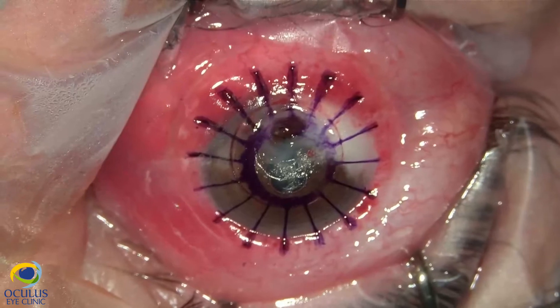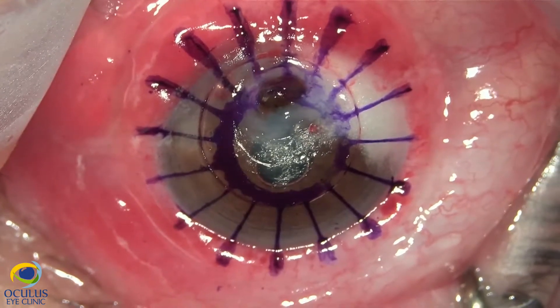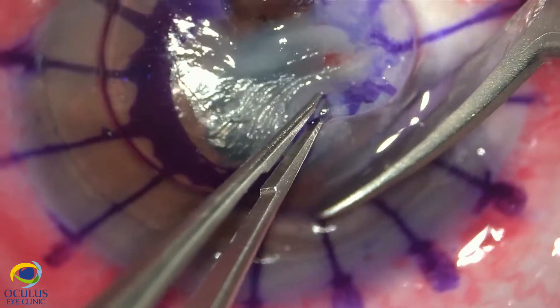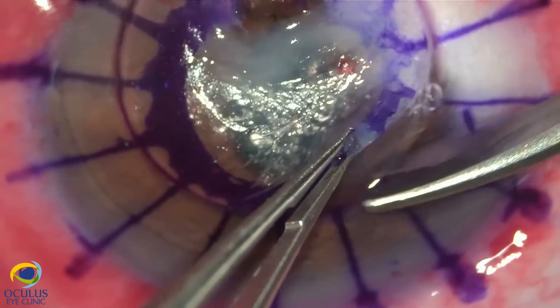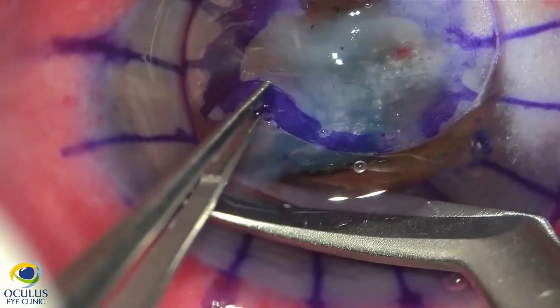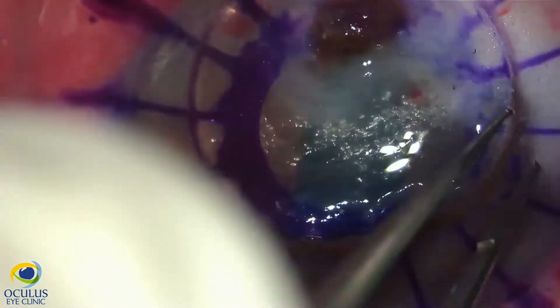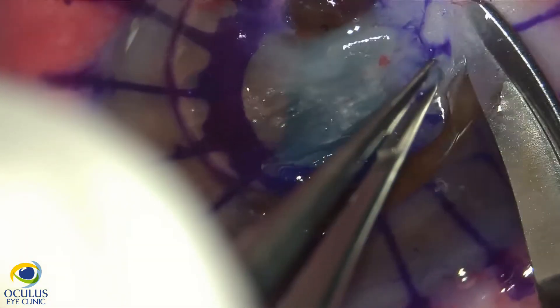We mark the cornea and follow a standard technique for penetrating keratoplasty. We mark the cornea for the future separate sutures. Now we cut to eliminate the host cornea, but we need to be very careful because as seen on the pre-operative OCT, there is no anterior chamber at all — the iris is completely stuck to the cornea with no space between them.